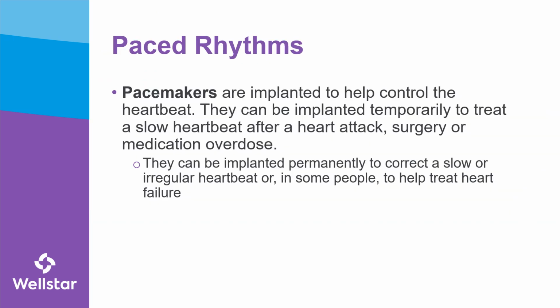Paced rhythms. Pacemakers are implanted to help control the heartbeat. They can be implanted temporarily to treat a slow heartbeat after a heart attack, surgery, or medication overdose. They can be implanted permanently to correct a slow or irregular heartbeat, or in some people to help treat heart failure.